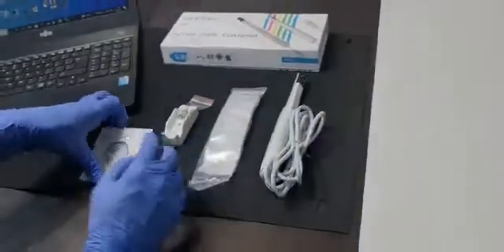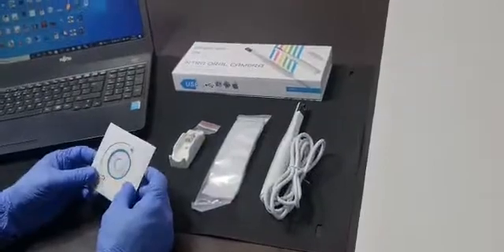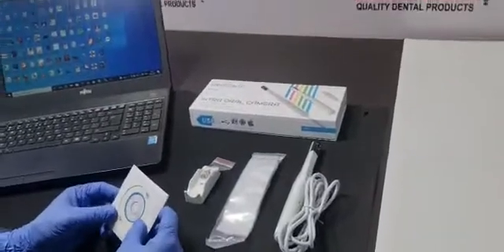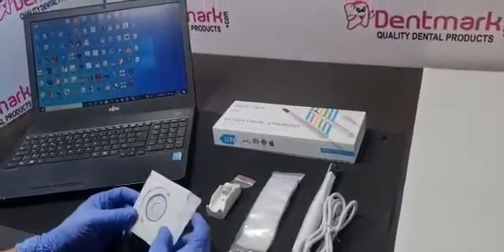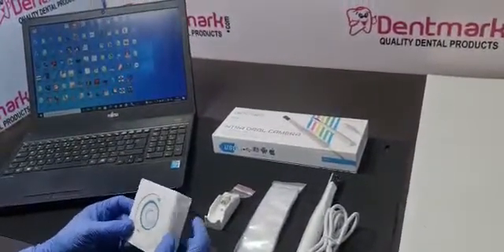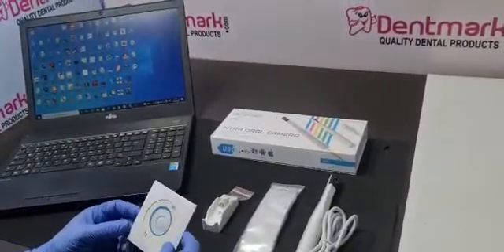You can install the software through CD or you can download the software from our website www.dentmark.com. I'll show you how to install the camera with the software.